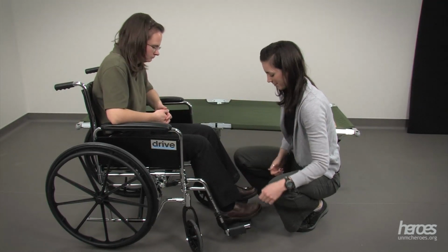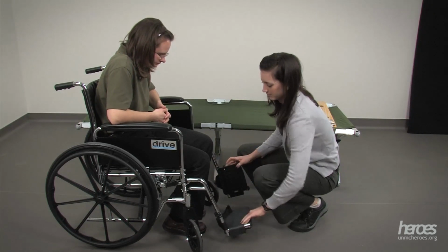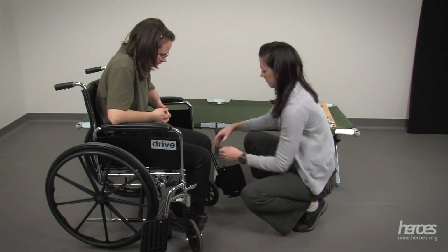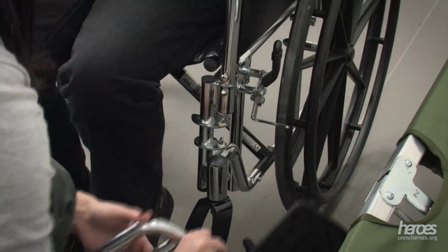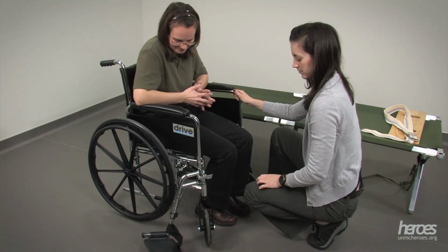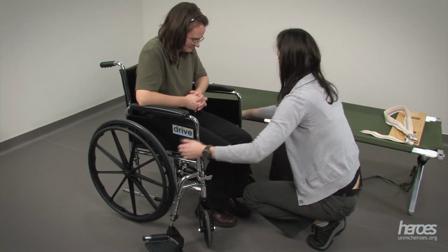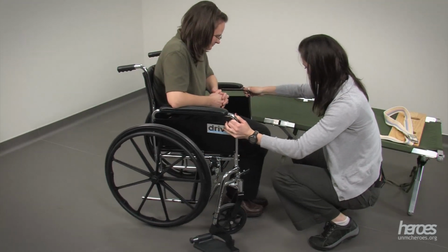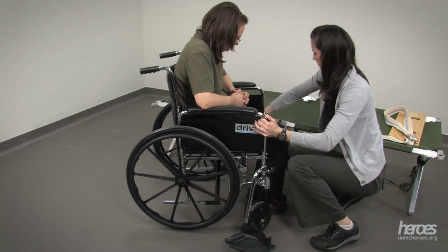Have the individual remove their feet from the leg rests. Then flip up the foot plates and swing away or remove the leg rests. The leg rest closest to the cot may need to be removed prior to positioning the wheelchair next to the cot. After removing the leg rest closest to the cot, unlock the brakes, reposition the wheelchair so that it is closer to the cot but still at a slight angle to it, and relock the brakes.